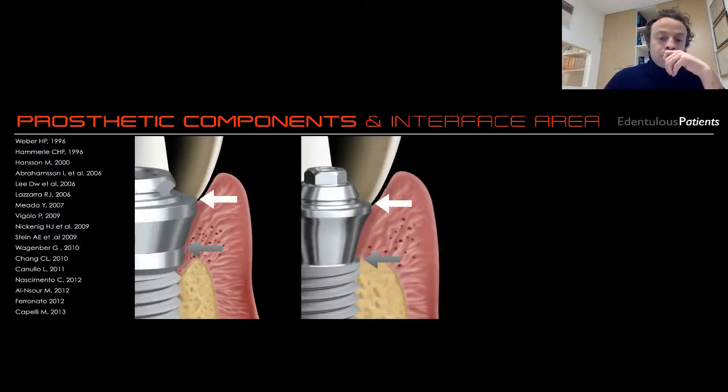Again, I want to stress once more the importance of working at the prosthetic level and always placing an intermediate abutment, in particular nowadays where we work with platform switching implants and conical connection, because the only way to keep this kind of configuration also in the full edentulous patient is to work with this kind of multi-unit abutment.